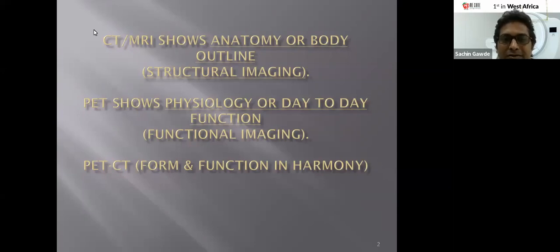CT and MRI show the anatomy or the outline, the structural imaging, while PET shows the physiology or the day-to-day function, called functional imaging. So when we put both together, we get form and function in harmony, which is the gold standard at present in cancer imaging.